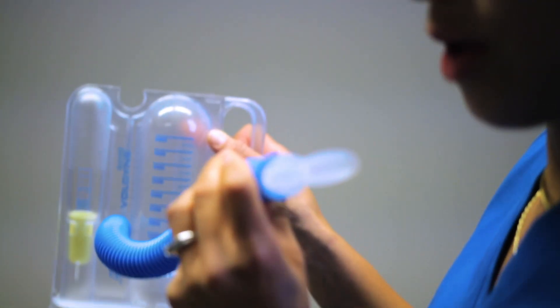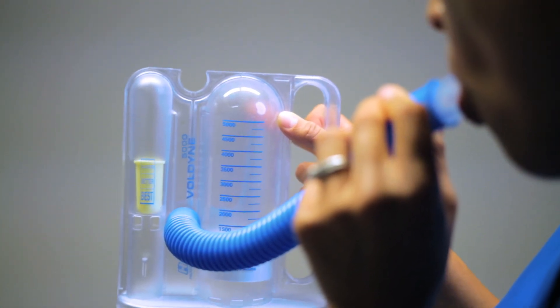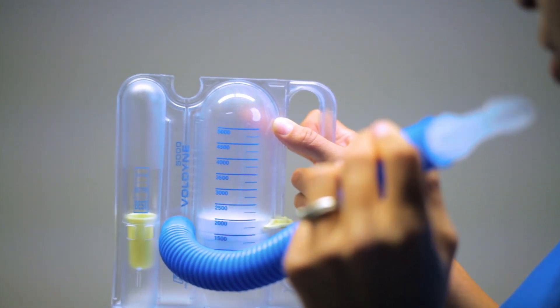I'm going to exhale out, then apply my lips around the mouthpiece and take a deep breath in slowly over three to five seconds. I'll watch the indicator move and float up, hopefully hitting best as my target. Once you have accomplished maintaining the float cup in the best range, you can advance to a larger volume goal.